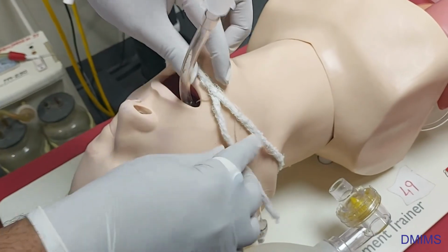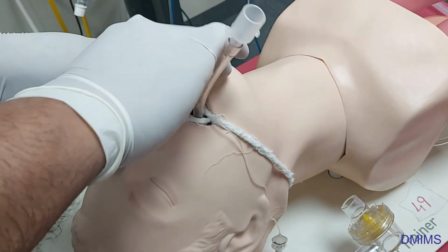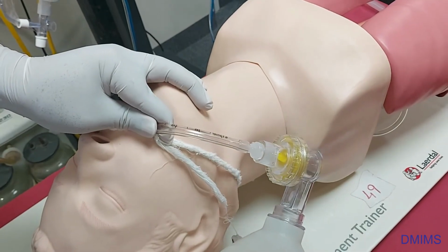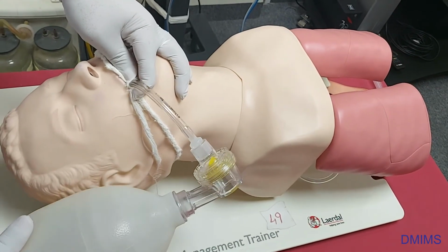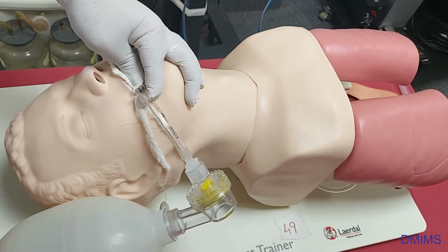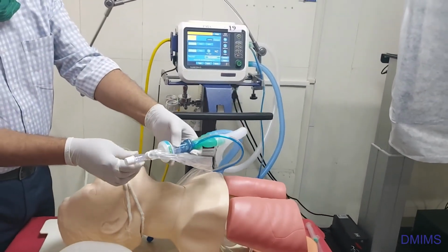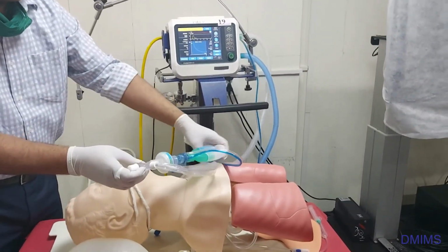Tying could be different with different people, or you can tape it. You can tape and secure the tube, connect the Ambu bag and ventilate. You should be sure that the marking is proper, and the depth of the tube should not be too far in or too far out, and you should see the ventilation. After this, we can connect to the ventilator, with the preset ventilator settings, and you can start the ventilation.